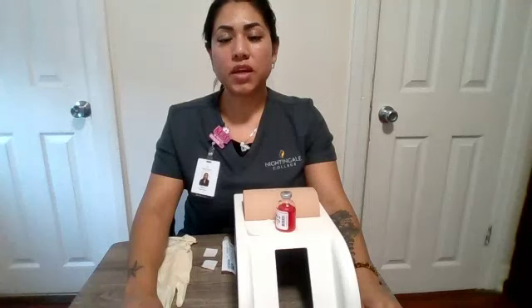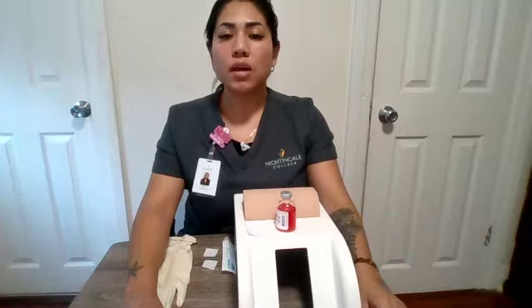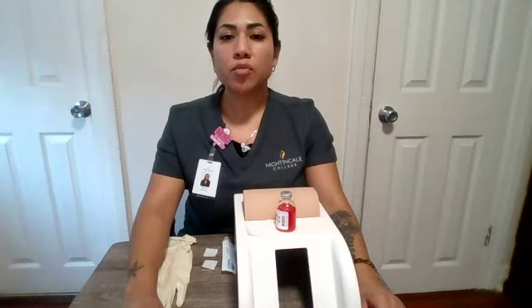Hi, my name is Dina, and today I will be administering the intramuscular injection. I have all my supplies here in front of me. I will start off by verifying the healthcare provider's orders.